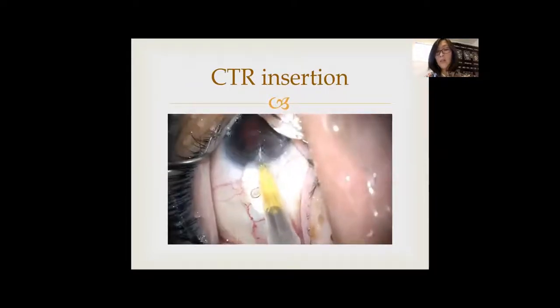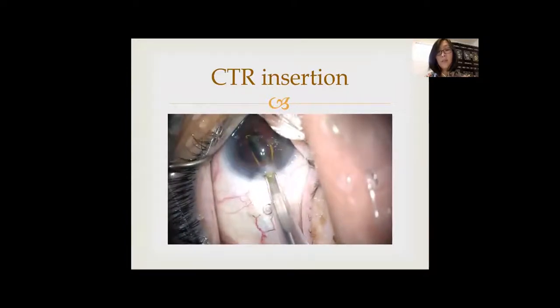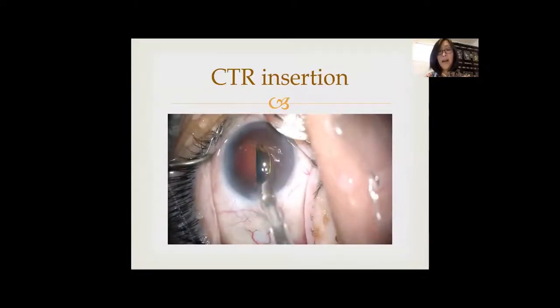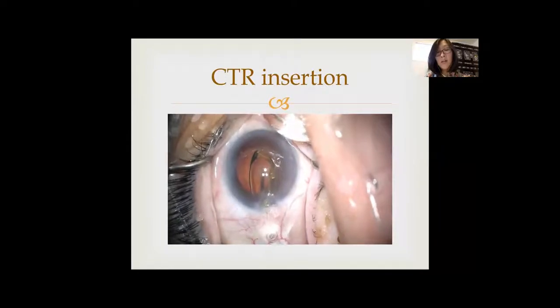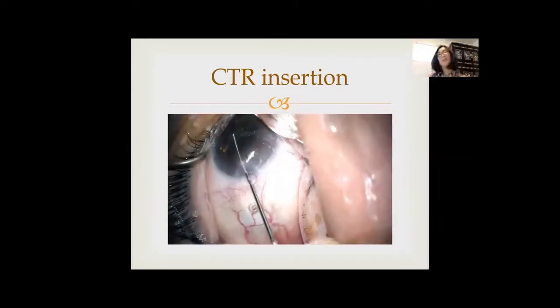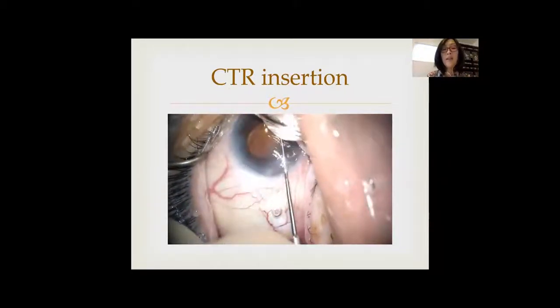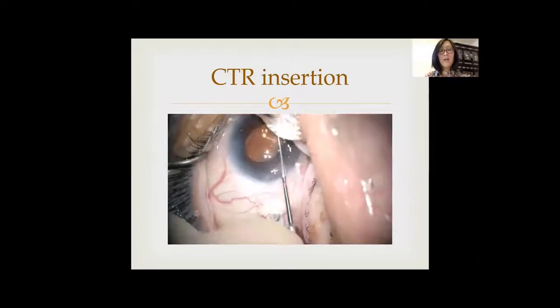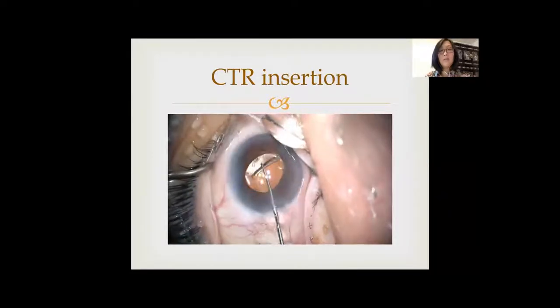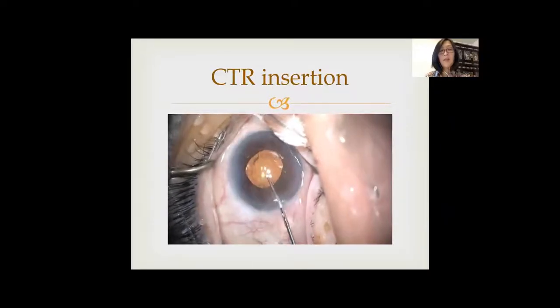And then you can see here, once we put that in, things have been stabilized, and I'm going to go ahead and put a 1-piece into the bag. Some would argue that it might be better to put a 3-piece, and I would say that's equally valid, to get that sort of help from the haptics that are going to push out there to give yourself a little bit of extra measure of support. So I'm going to be very careful in placing those haptics into the capsular bag.